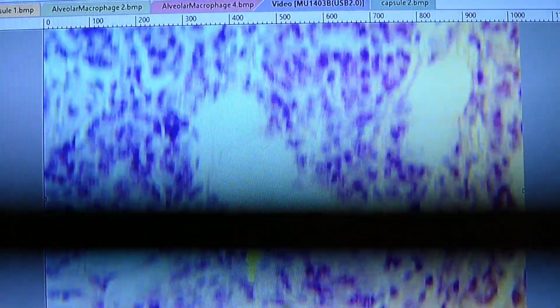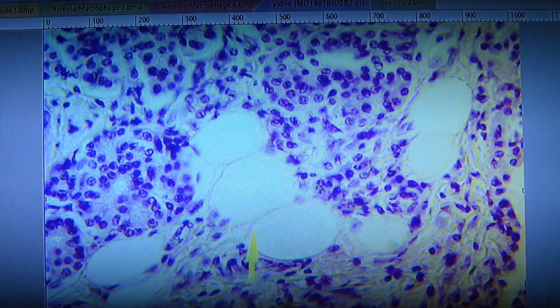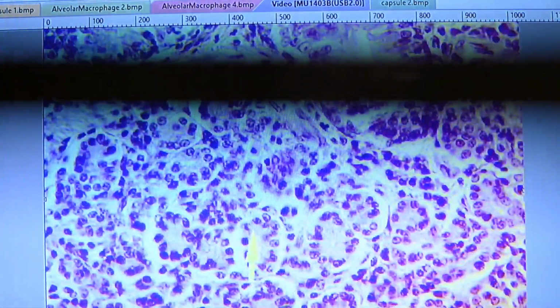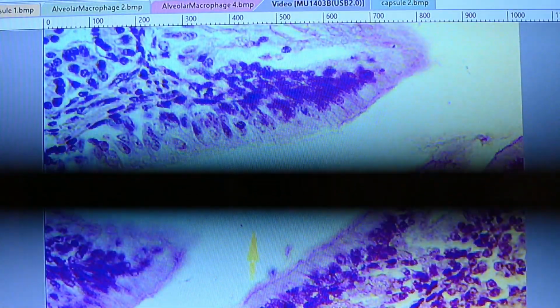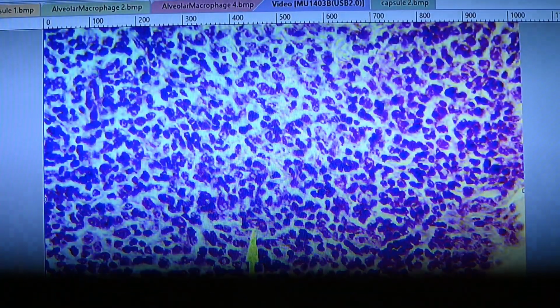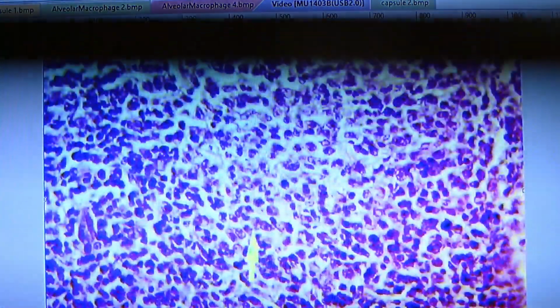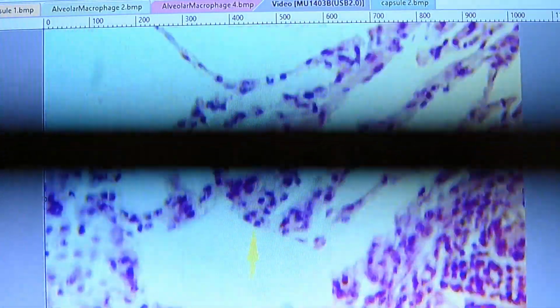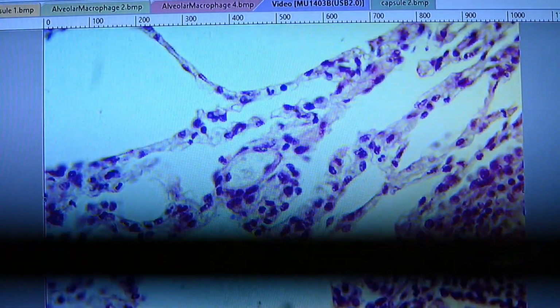Oh, here's a little bit of fat tissue. Not what I expect to see out there in the lung, but there's some adipose tissue along with those connective tissues that reach out along those major passageways. And here we have an abundance of lymphatic tissue, diffuse lymphatic tissue following the bronchiole in the wall of the bronchiole. Now we'll find a smaller bronchiole, more examples of bronchioles.